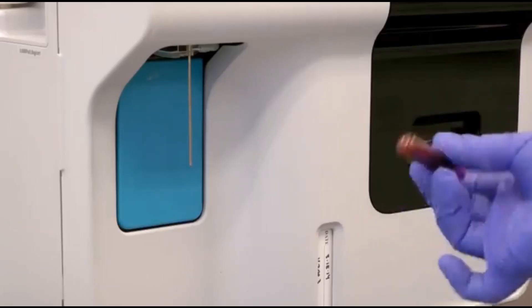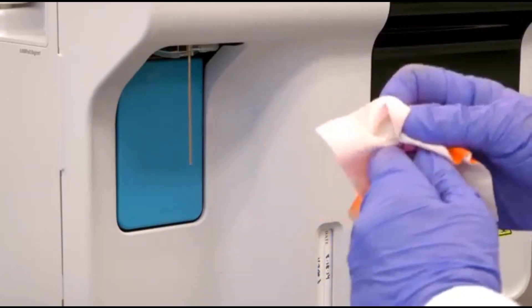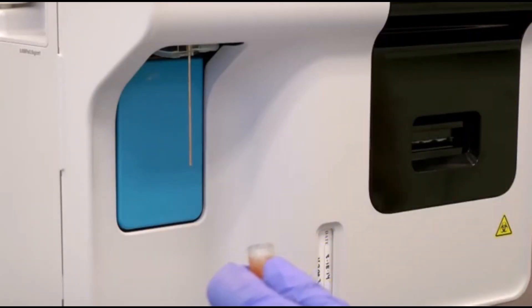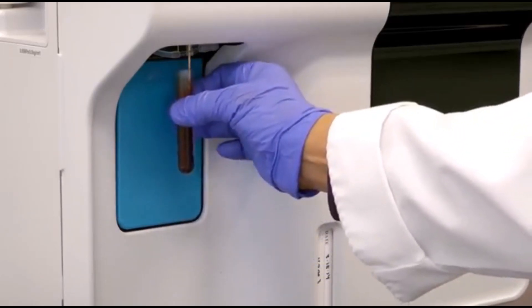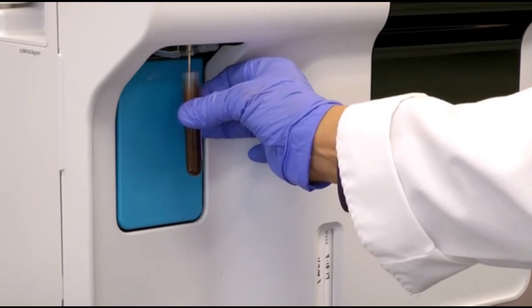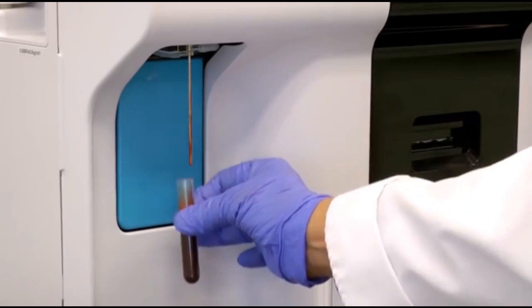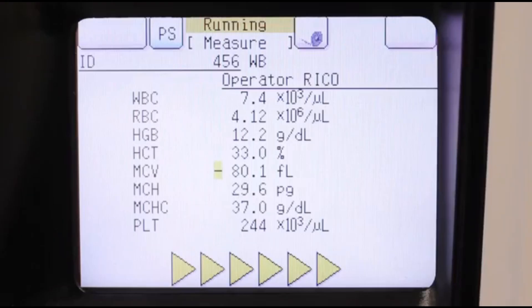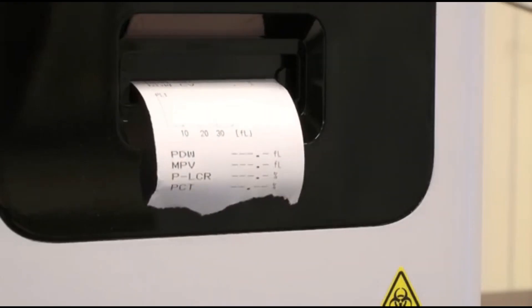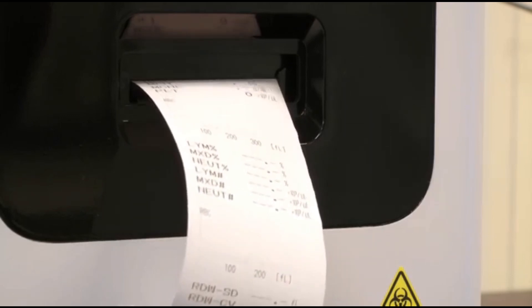Mix the sample by inverting it ten times. Remove the cap and hold the sample up to the aspiration probe. Press and release the start button behind the aspiration probe. The XP300 will aspirate 50 microliters of sample. When two beeps are heard, you can remove the sample. Results will be displayed in about 60 seconds and can be printed on the internal thermal printer, the graphic printer, or output directly to your LIS.